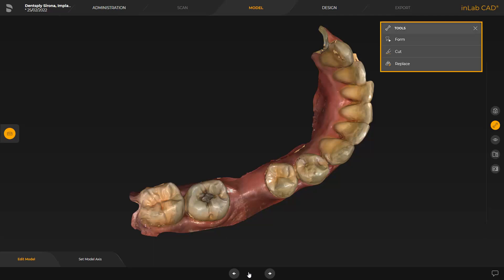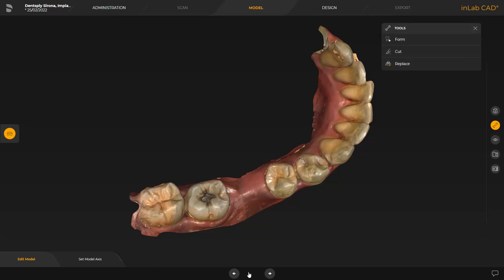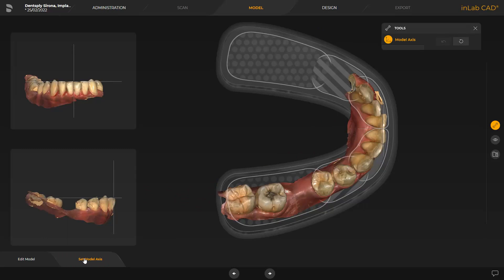In this phase, we can use the tools to make some modifications. In our case, we switch to the next step, set model axis. The model axis is automatically suggested by the software. If necessary, modifications can be performed in the three views. The alignment is needed for the calculation of optimum initial proposals.